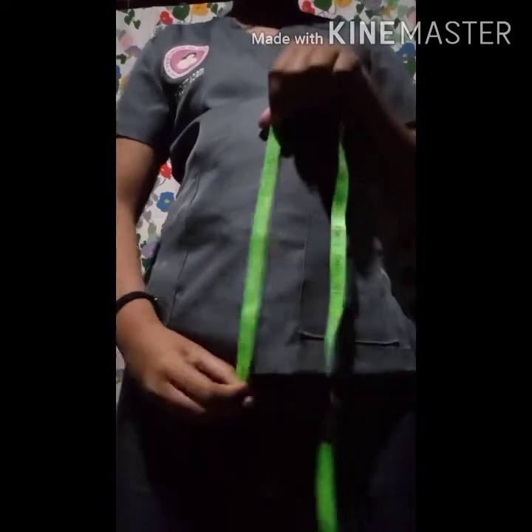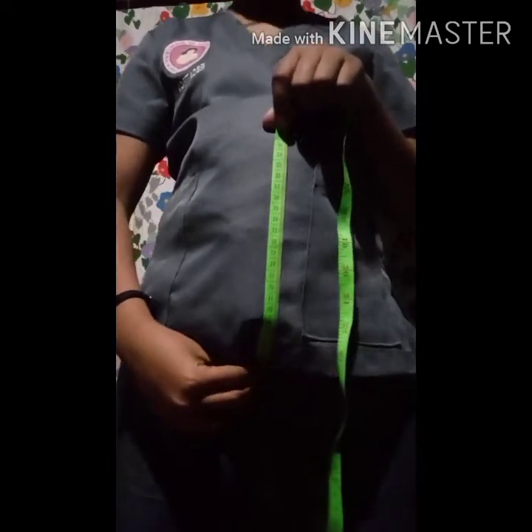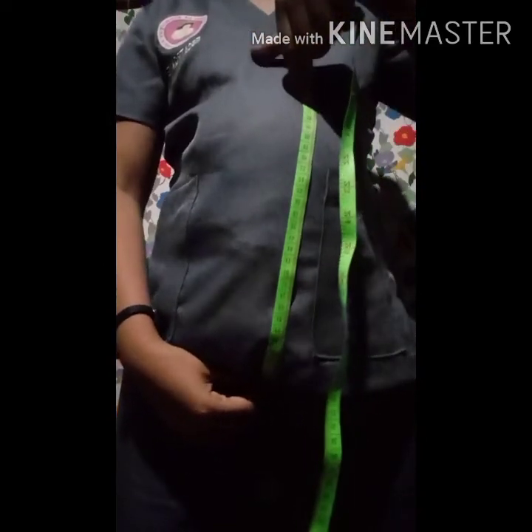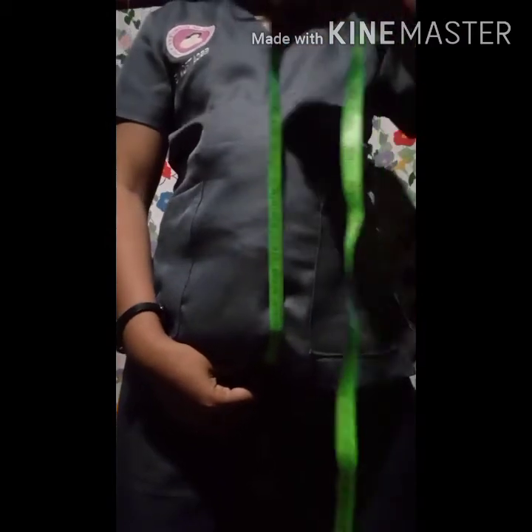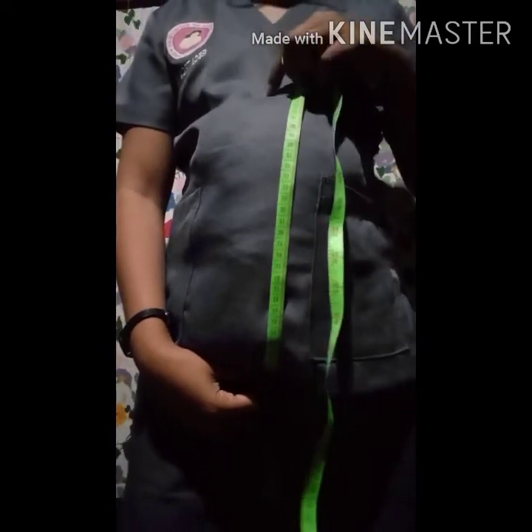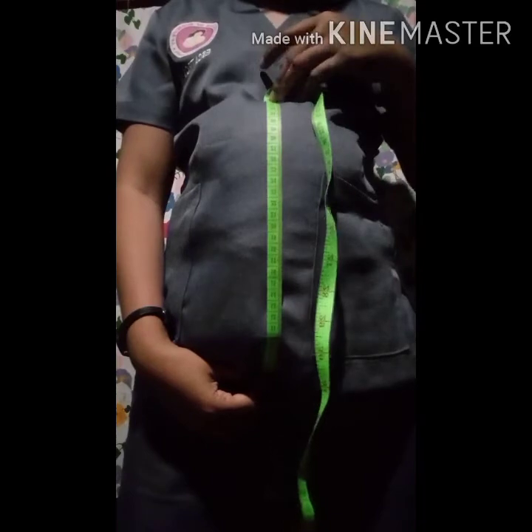So if this is my symphysis pubis, I will put the zero mark of the tape measure there. I will then extend the tape measure up to the fundus. Take note that when putting the tape measure at the fundus, you don't need to press it down — instead, you just place it there swiftly.